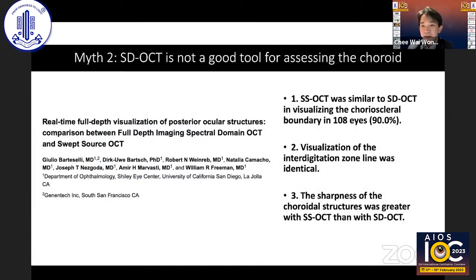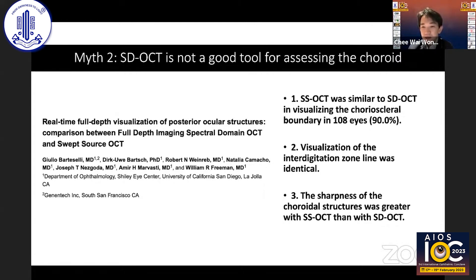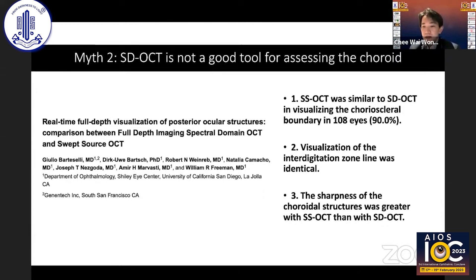Myth number two: spectral domain is not a good tool for assessing the choroid. Swept source, by virtue of its longer wavelength, has a natural advantage for imaging below the retinal pigment epithelium. However, with enhanced depth imaging (EDI), spectral domain is also a great way of visualizing the choroid. In this study, both modalities were able to image the choroidal-scleral boundary in more than 90% of eyes, with swept source performing slightly better in terms of sharpness, but the interdigitation zone was clearly visualized with both.